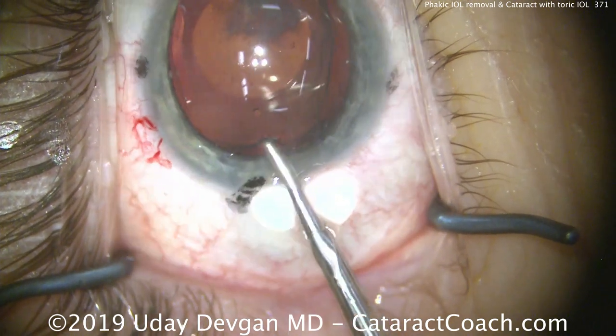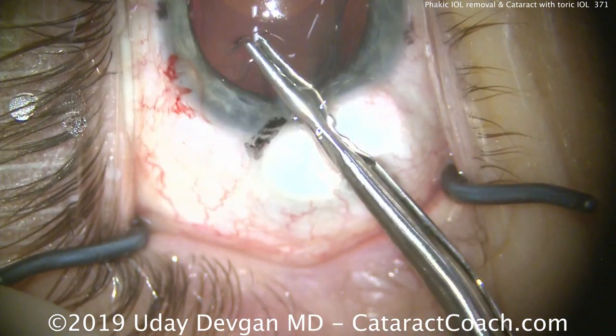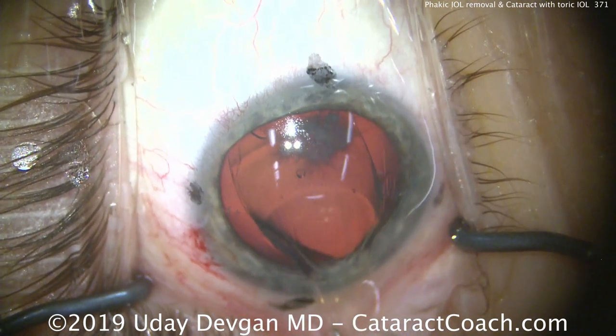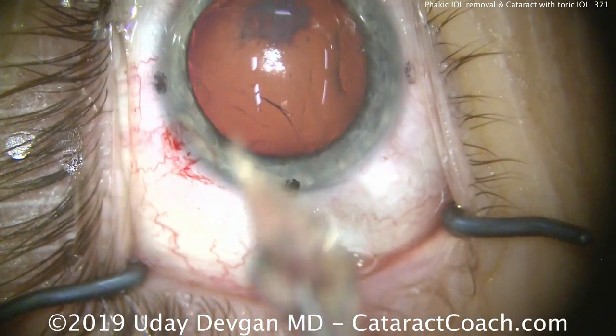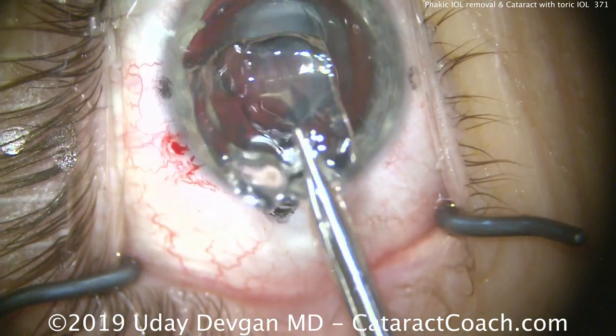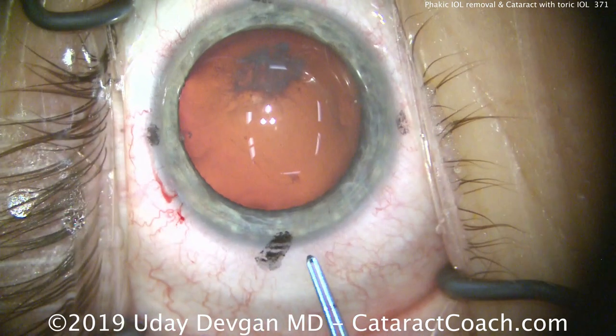Now we can simply grab it with specialized forceps. Because the lens is so thin, if we pull it straight out, it'll fold on itself and we can take it out intact. There's the entire lens, completely intact. So that was easy enough — we're ready for our cataract surgery.